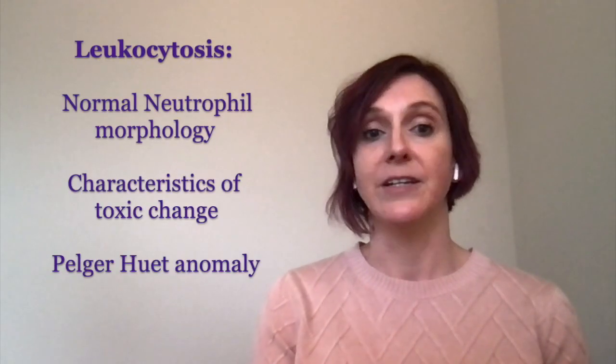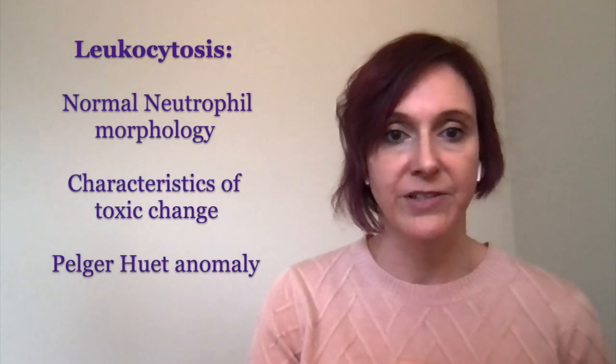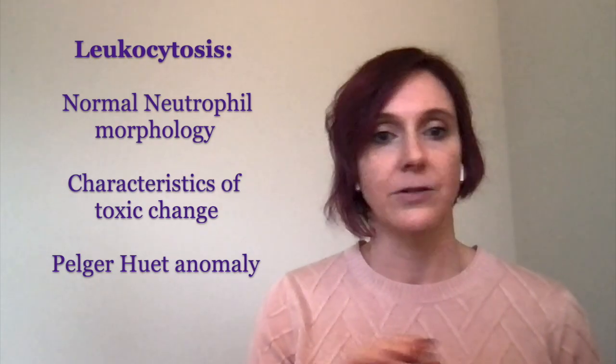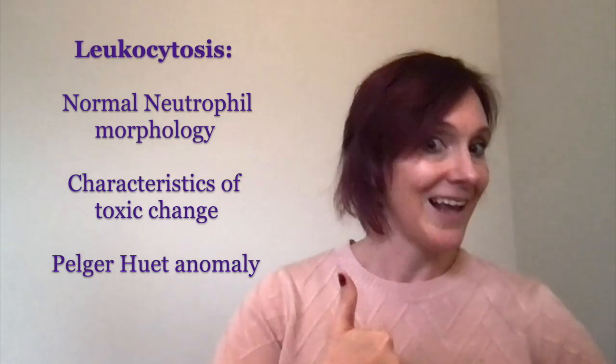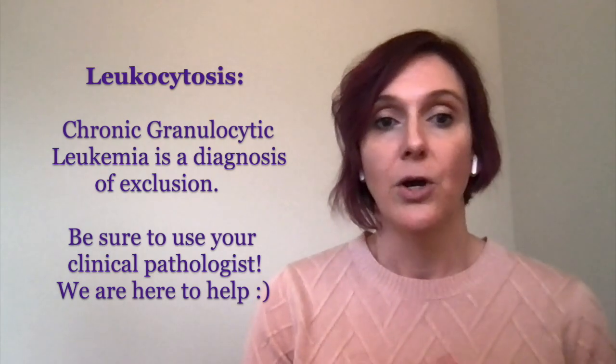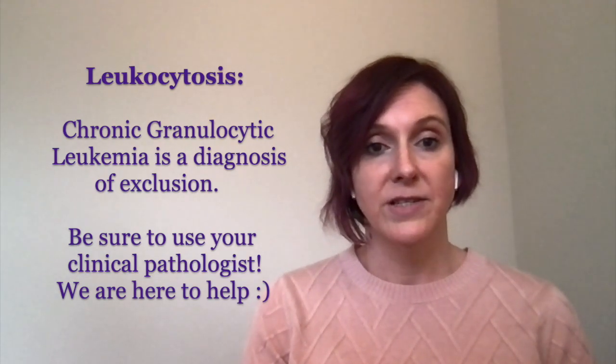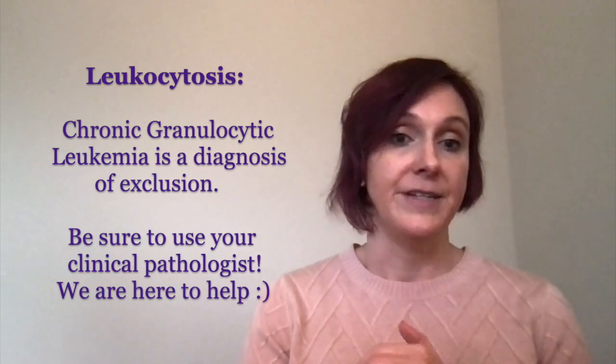Patient not sick and looking inflammatory, but has a bunch of youngsters out in circulation. Think about Pelger-Hewitt, send it off to your clinical pathologist with a detailed history. What about long-standing inflammation where you start getting marked neutrophilias that start approaching that leukemoid range? You want to make sure you're ruling out all things inflammation before landing on something like a chronic granulocytic leukemia, which is a diagnosis of exclusion. Make sure you utilize your clinical pathologist, send off a detailed history.